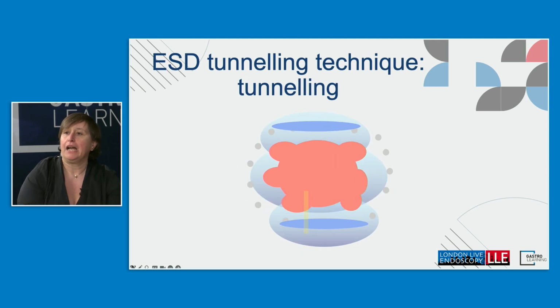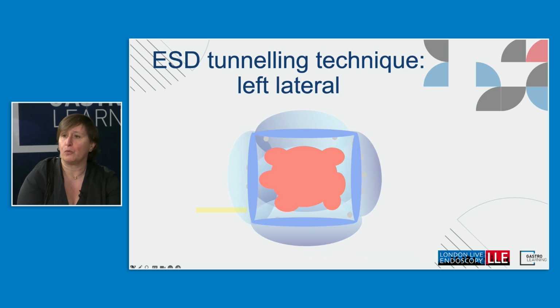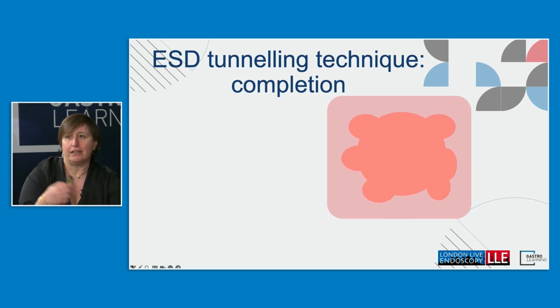The next step is going to be opening a distal gate on the anal side of the lesion. And then once that's happening, I'm going to be traveling beneath the polyp, creating a tunnel until I meet the proximal gate I have opened initially. Once that's done, we will tackle one of the side circumferential areas, then we will move to the other side, and hopefully then we will have the lesion completely removed.